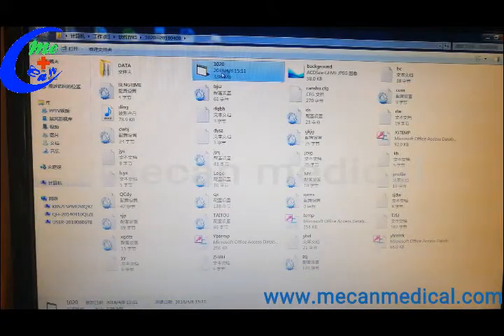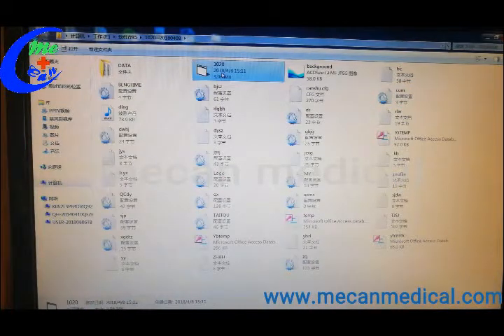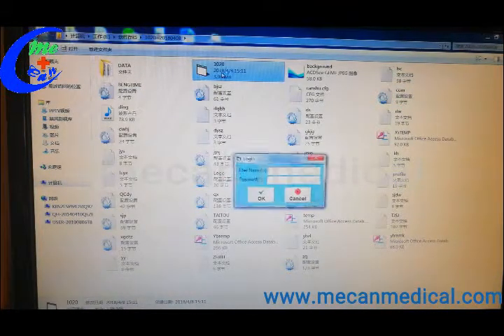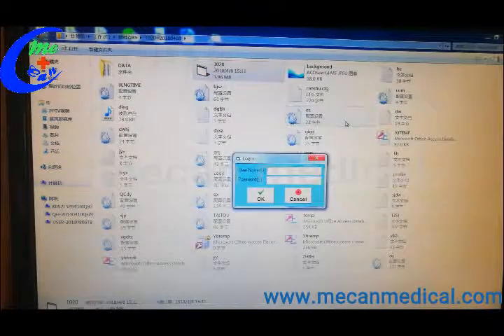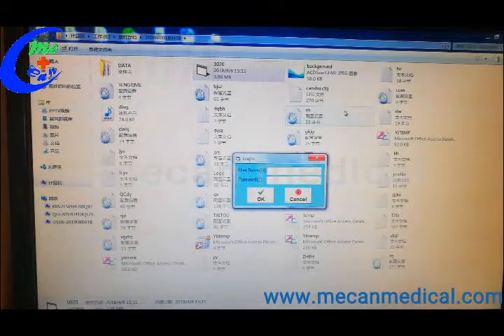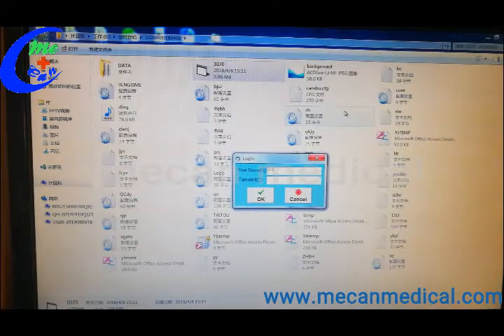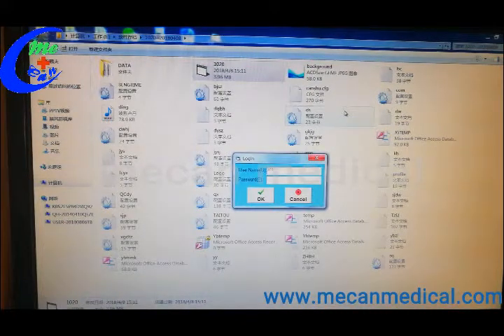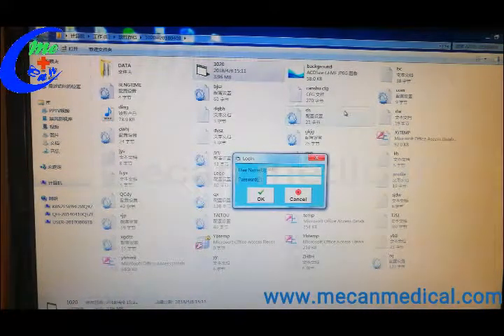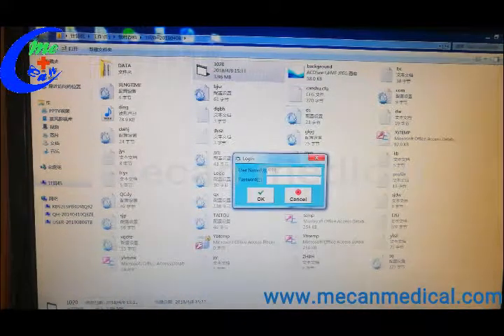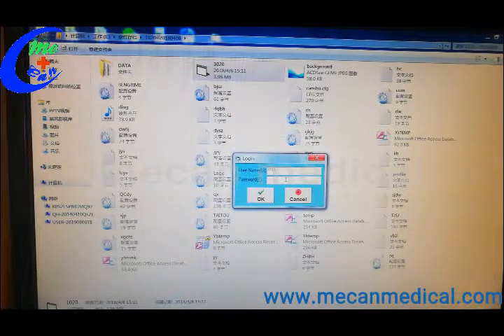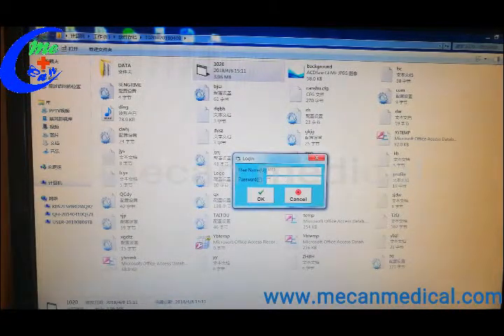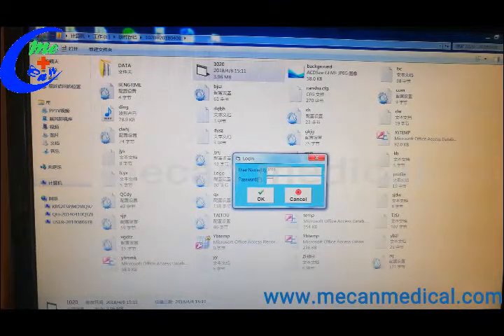Then open the software. Username is 1-0-0-0. Password 1-0-0-0.